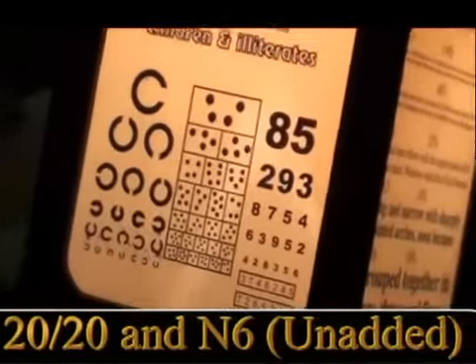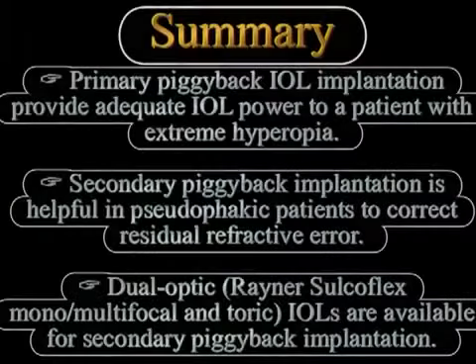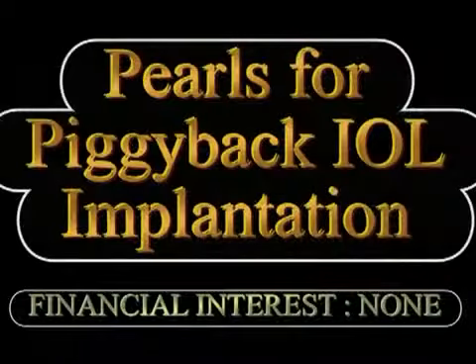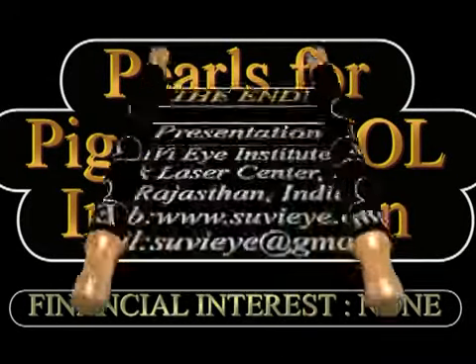The child achieved very good distance and near vision unaided at the end of surgery. To summarize, piggyback IOL implantation — first popularized by Dr. Gayton in 1993 — has become a very useful technique for managing refractive surprises after cataract surgery and for primary piggyback implantation in high hyperopia requiring very high IOL powers. Different combinations of monofocal, multifocal, and toric IOLs can be used to achieve extremely good refractive results in these high hyperopia cases.